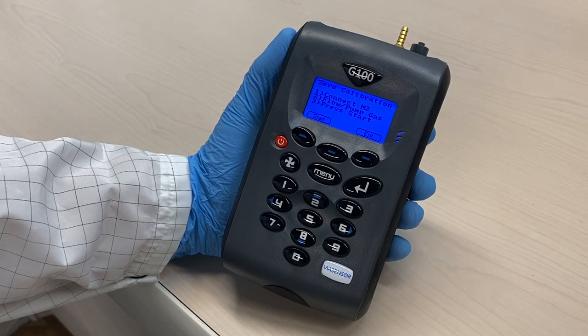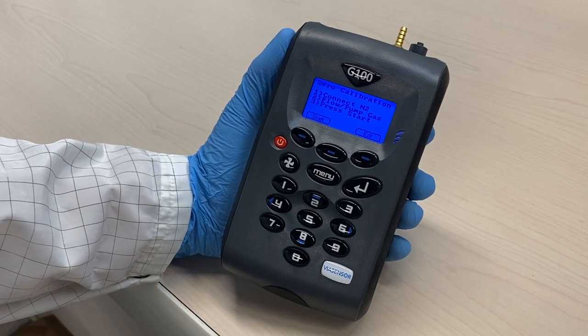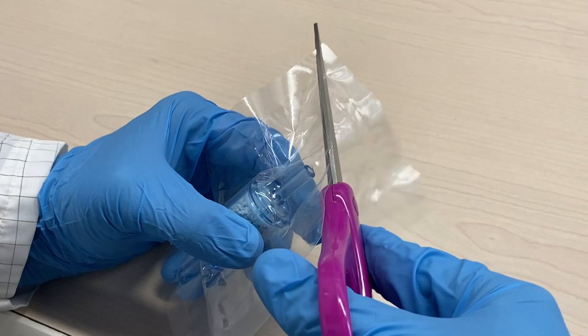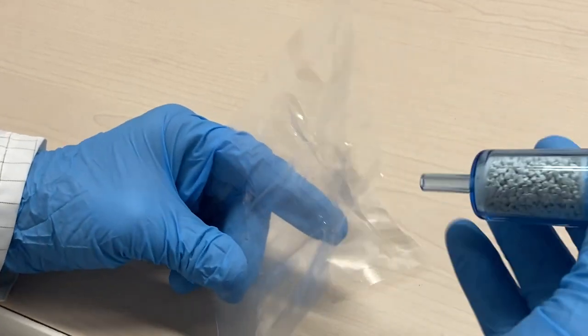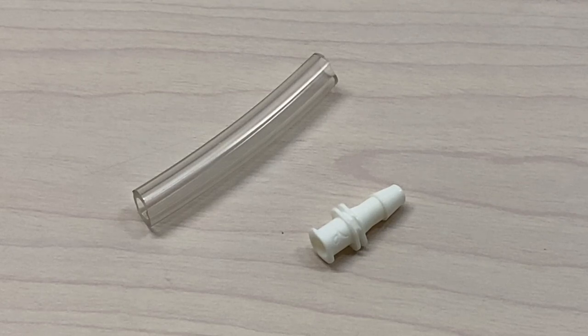For maximum accuracy, it is recommended the CO2 channel be zeroed using certified 100% nitrogen gas. However, if nitrogen gas is not available, the optional SodaLime filter kit can be fitted to the gas inlet. This allows the user to perform a zero using normal air, as the SodaLime filter will absorb virtually all CO2 from the sample air.